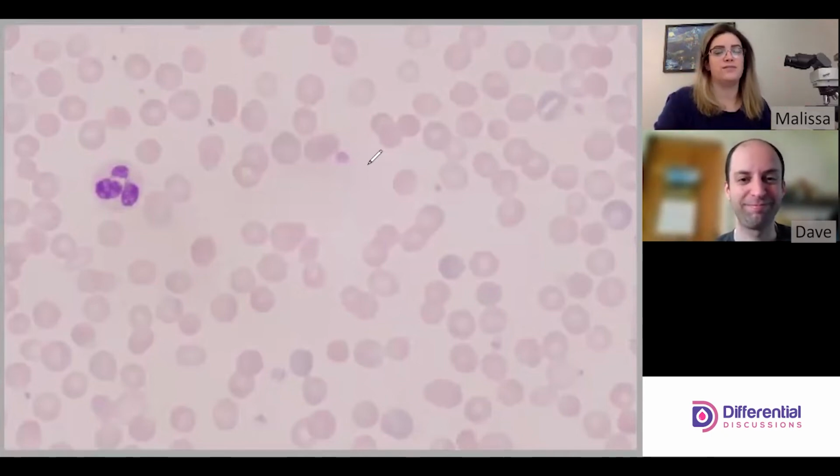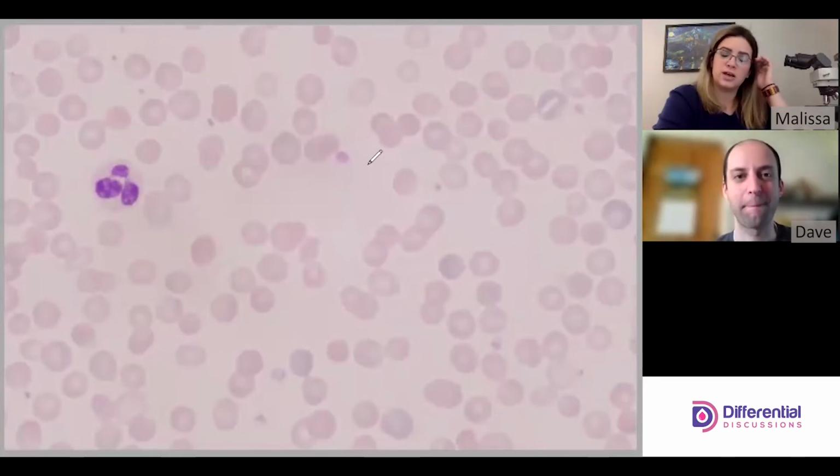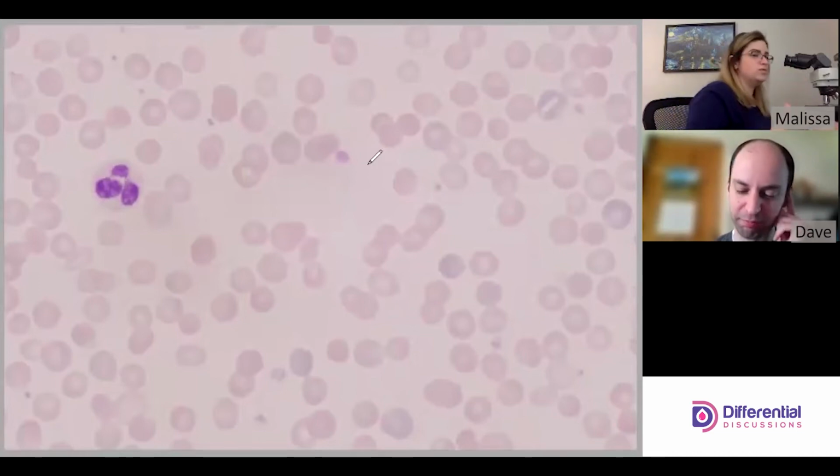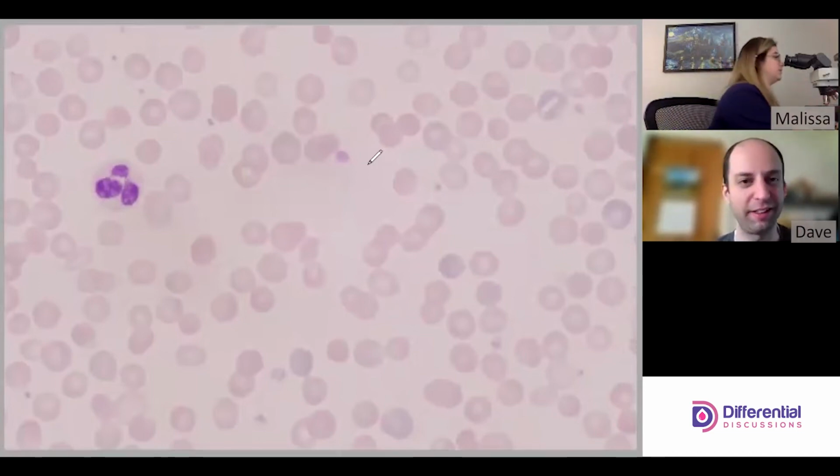It's just you don't have enough red cells together, and so you smudge them and smear the hemoglobin throughout the whole cell so that it makes it look like they're spherocytic, but they're really not. So the key is to make sure you're not in the feathered edge and to make sure you're actually in the good part of the slide. So let me just move towards the feathered edge. I think that's a great exercise.